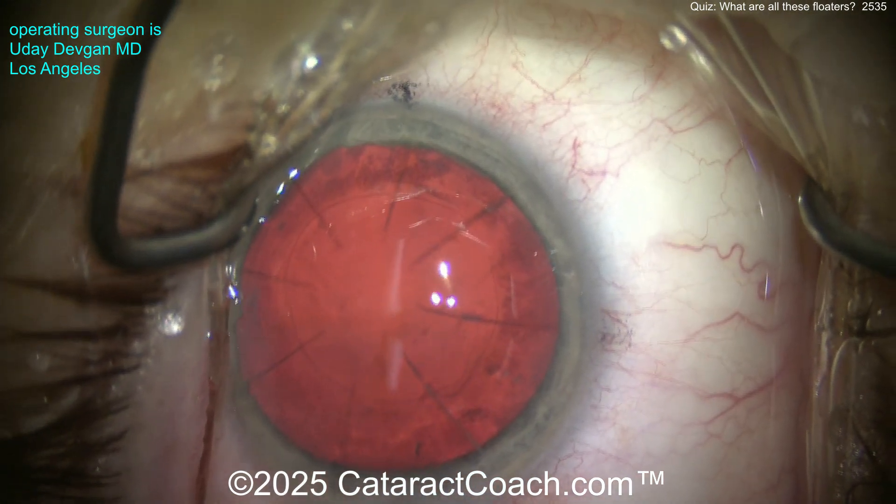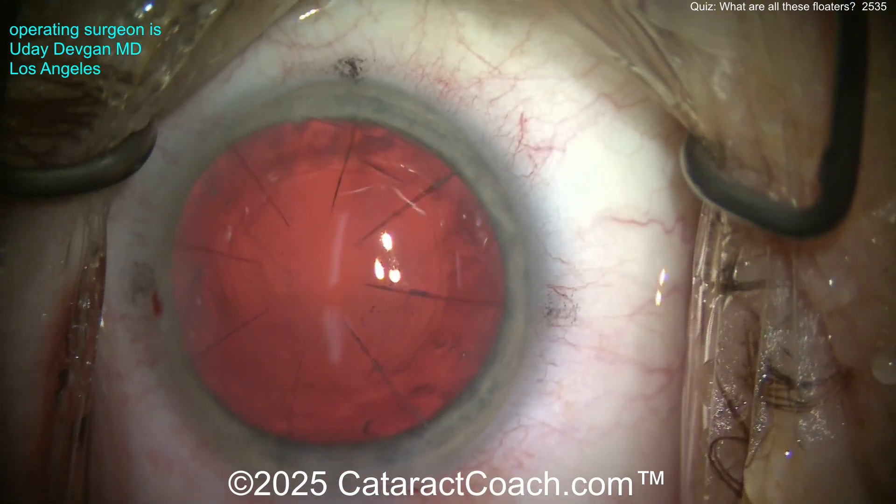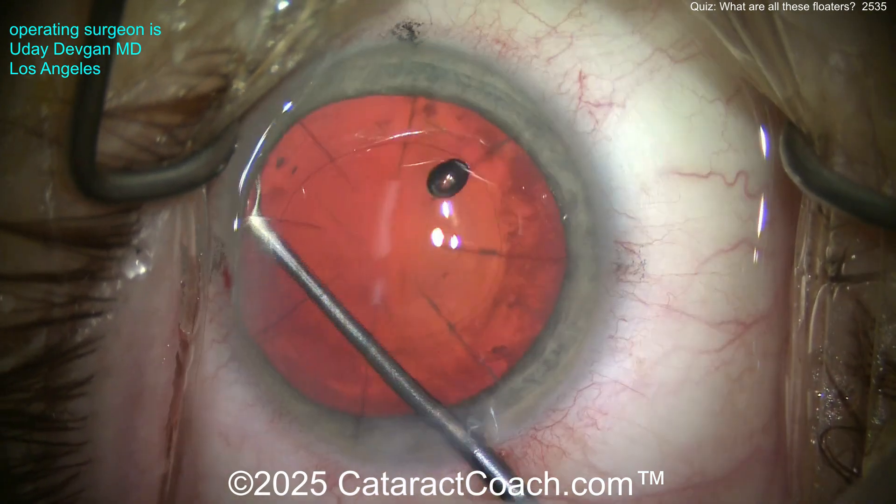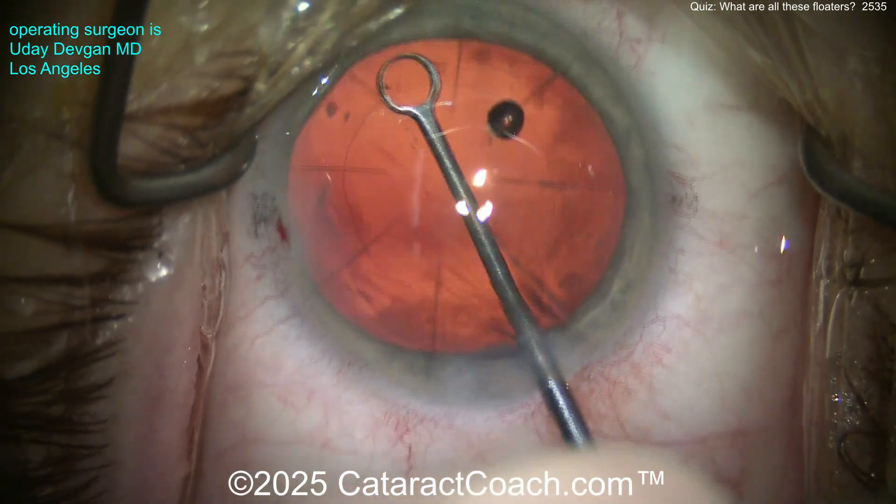I'll put in our cohesive viscoelastic to expand the capsular bag, and we're going to polish up the undersurface of the anterior capsular rim. You can see those beautiful eight RK cuts, so we've got to take that into account in our lens calculations.